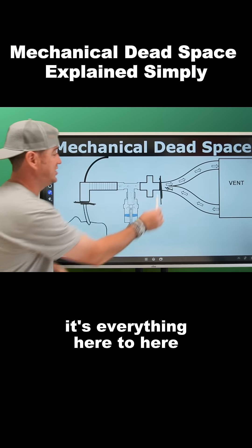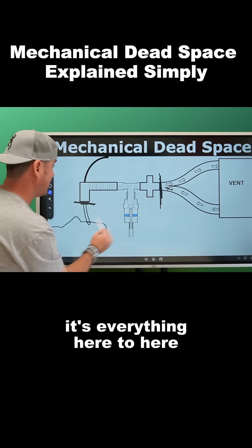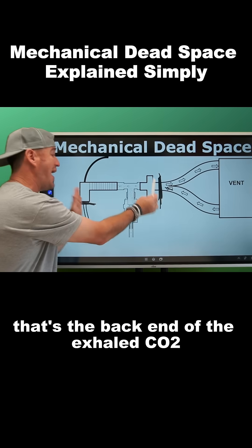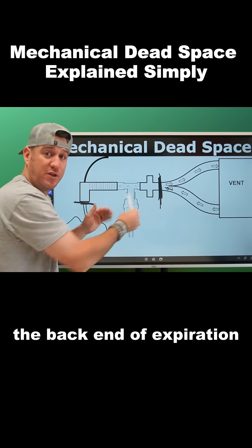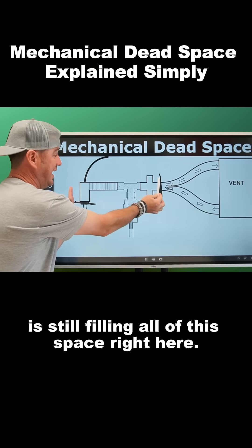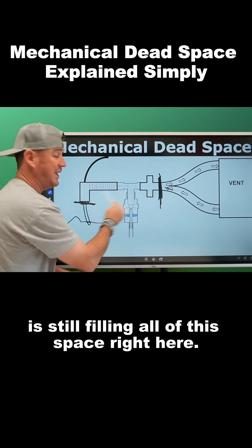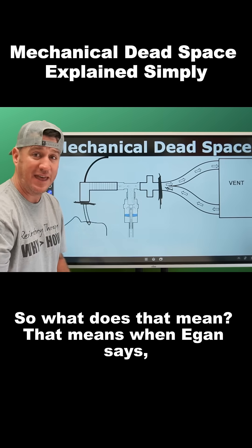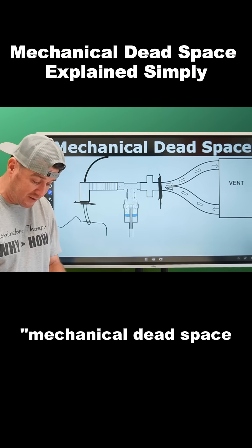Everything from here to here—that's the back end of the exhaled CO2, the back end of expiration—is still filling all of this space right here. So what does that mean? When Egan says mechanical dead space is defined as the volume of gas rebreathed.